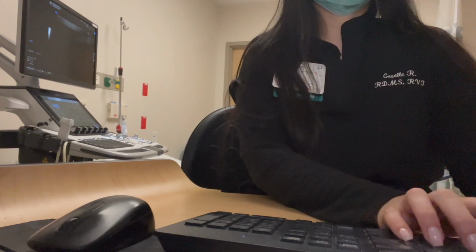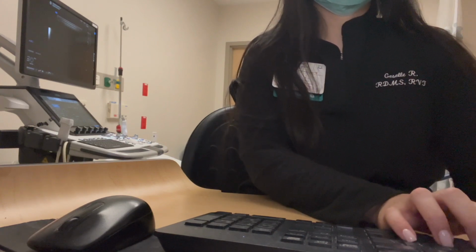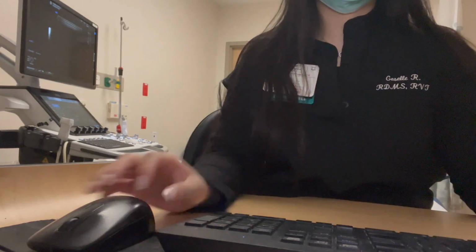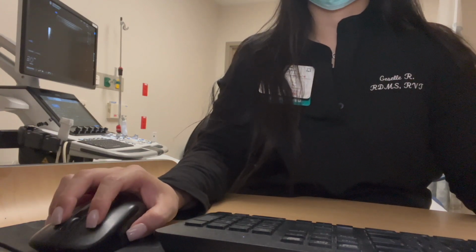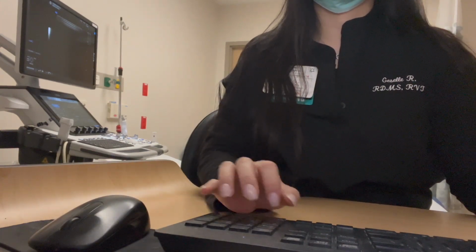For example, at one hospital that I work at, they just write down what they see onto the machine itself. But for this hospital, I actually have paperwork that I have to fill out. So that's what I'm doing here. After each scan, I'm just going to fill out the paperwork and explain what I see with each exam.